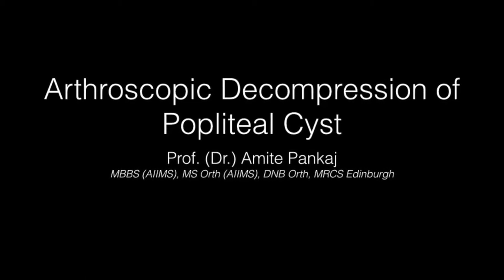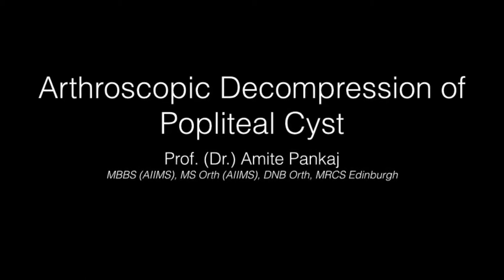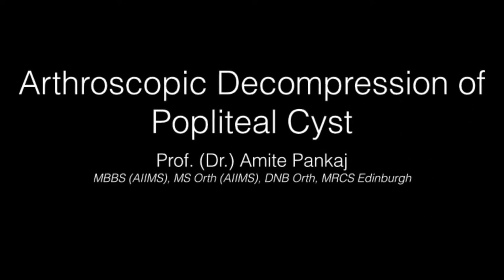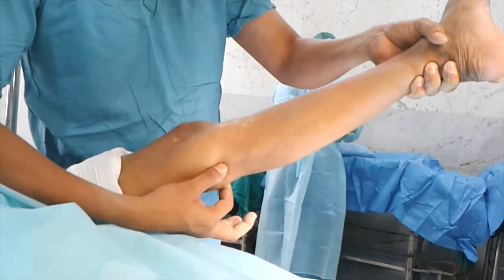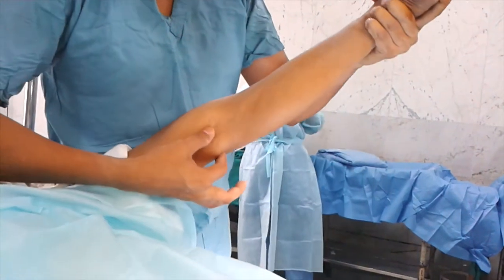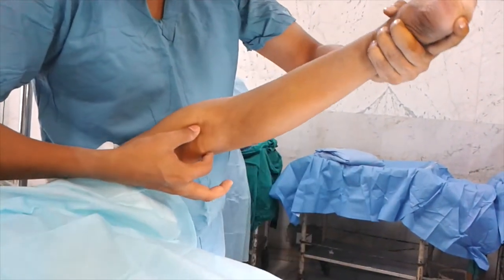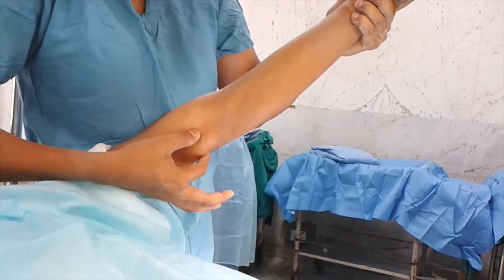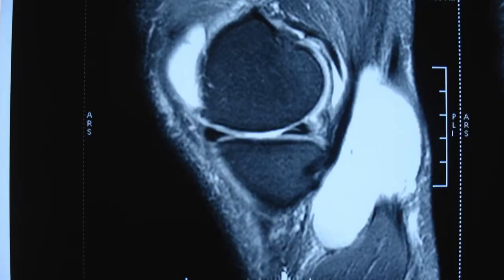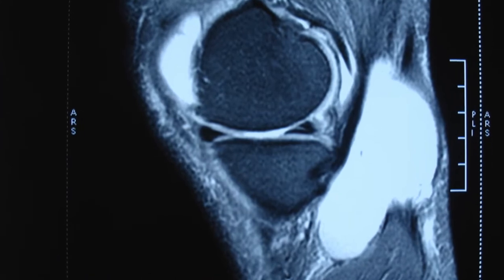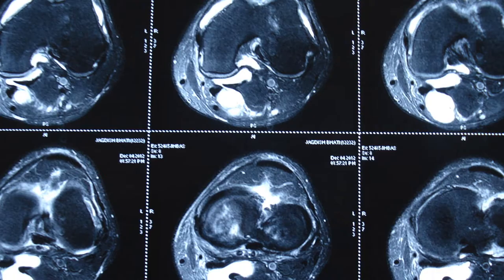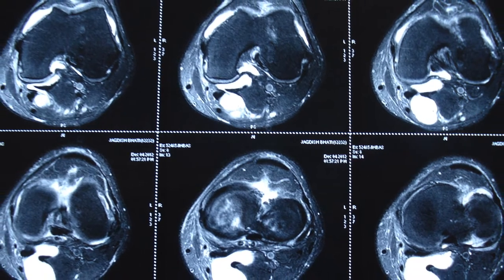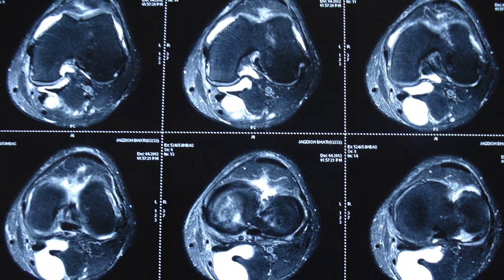In this video, we are going to demonstrate the arthroscopic decompression of popliteal cysts. Here is a 50-year-old lady with osteoarthritis of the left knee and a large Baker cyst in the popliteal fossa. There is a horizontal tear of the medial meniscus. The communication between the capsule and the popliteal cyst is quite visible on axial sections.